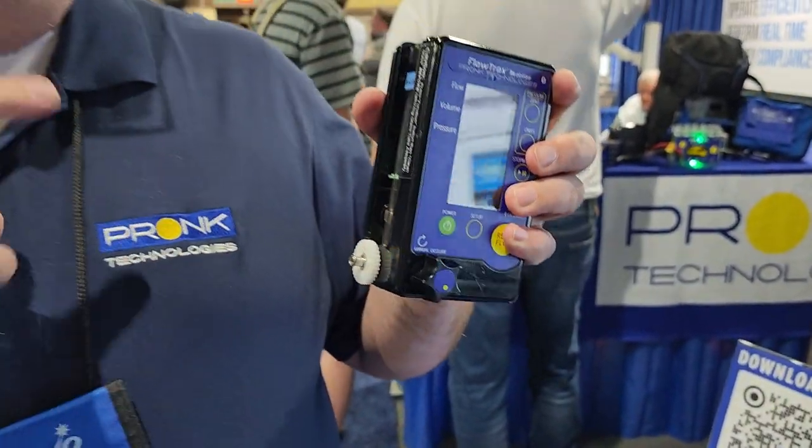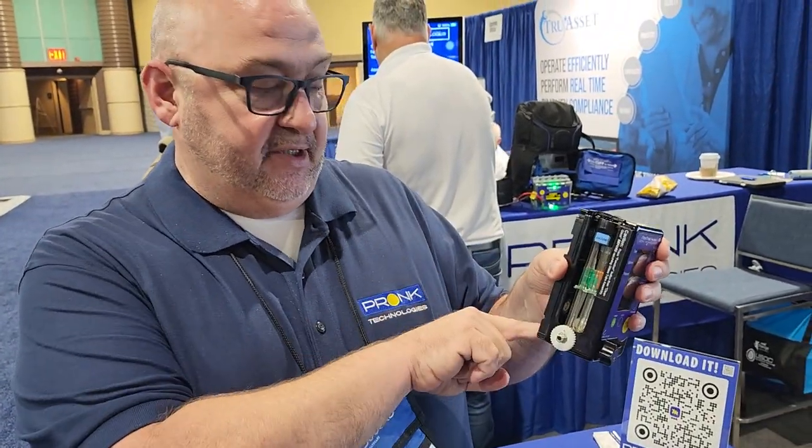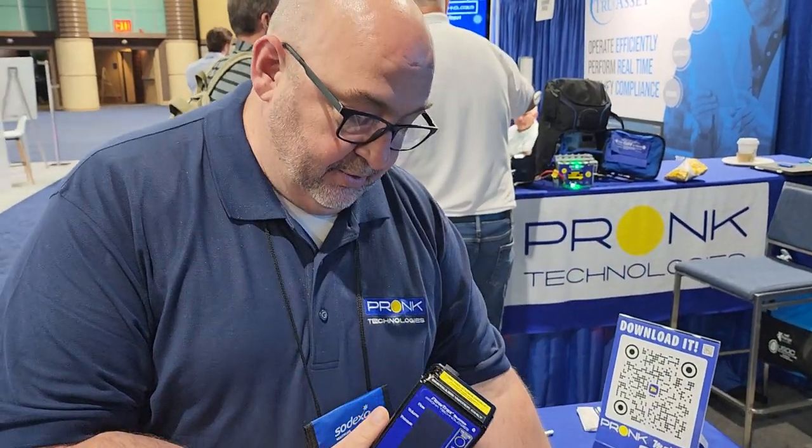One thing to make sure: do not cross these tubes between pumps. If they're serialized, they should stay with the same pump because they're calibrated based on that specific pump.